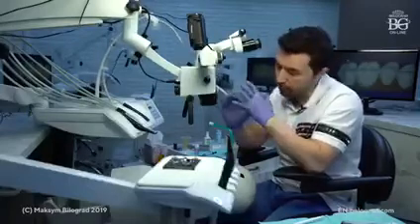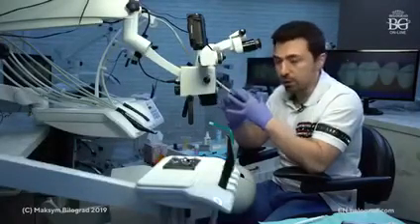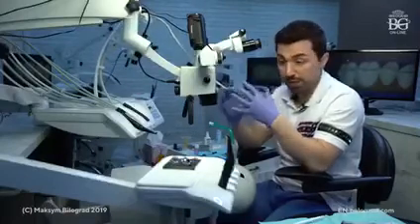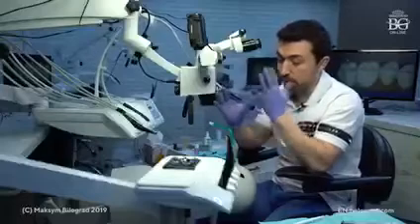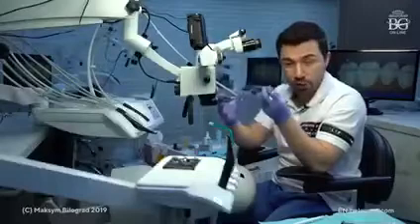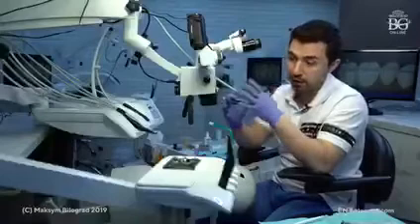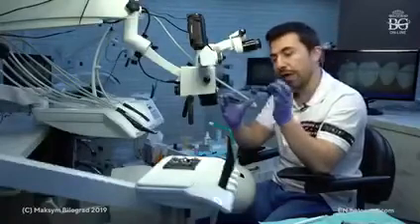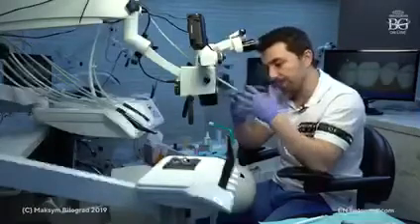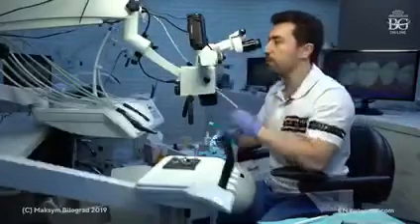Okay, so you have to make a really nice internal surface to give your dental technician conditions not to use a thick spacer, because if the spacer is thick, all this space between the veneer and the tooth will be filled with composite resin, which is a really thin, very soft substrate, and ceramic being a rigid material, if it is thin and has something soft underneath, it can break. Okay, so that's why the internal surface has to be really, really smooth.